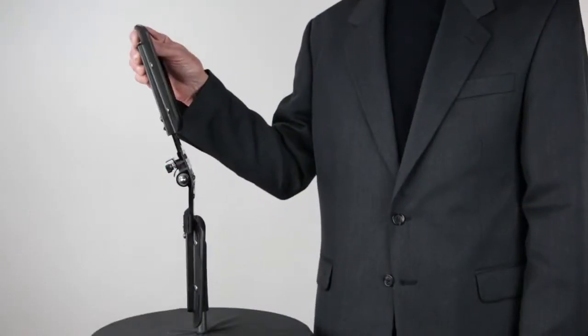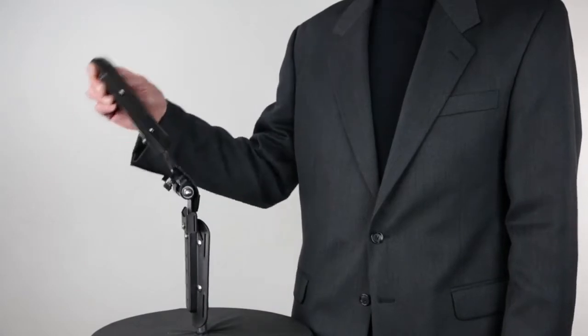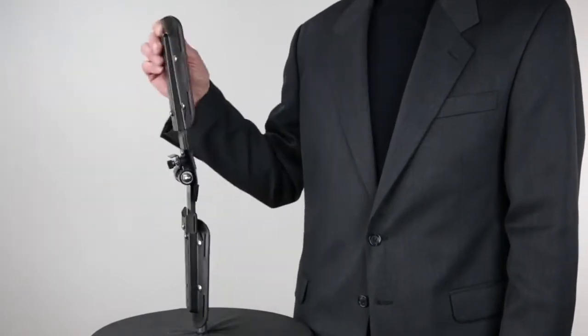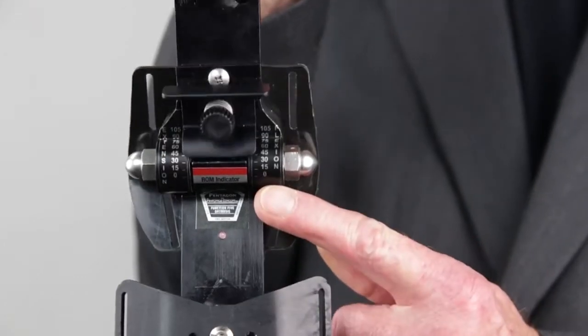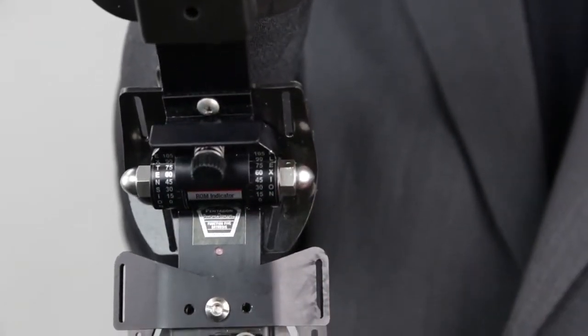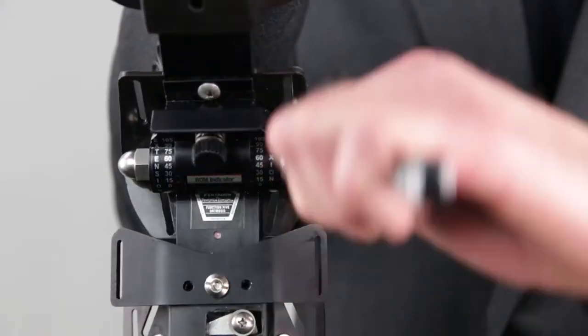The fixed motion lock function allows for setting the flexion and extension limitations into one fixed or locked position. From the free motion position, flex or extend the joint to the desired position corresponding to the red range of motion indicator, then turn both chrome nuts clockwise until tightened.